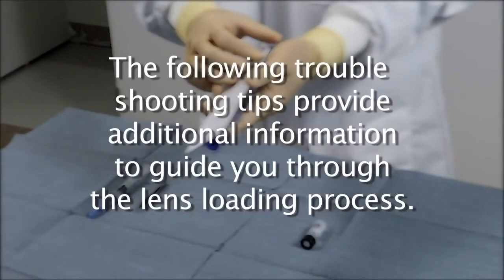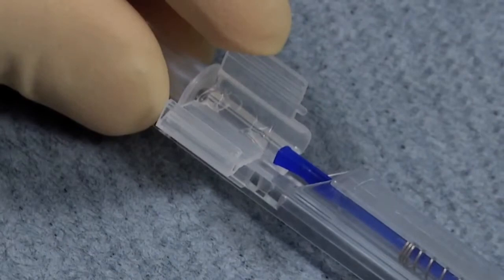The following troubleshooting tips provide additional information to guide you through the lens loading process. When closing the cartridge wings, note that if the cartridge is closed too far, the leading haptic may be pushed into the tunnel. This shows the correct method of only slightly closing the cartridge wing prior to lens compression.